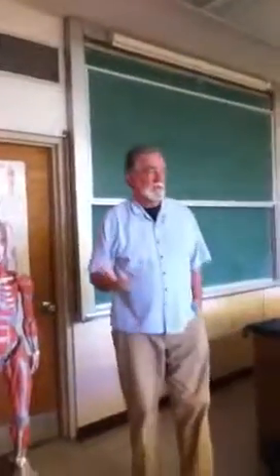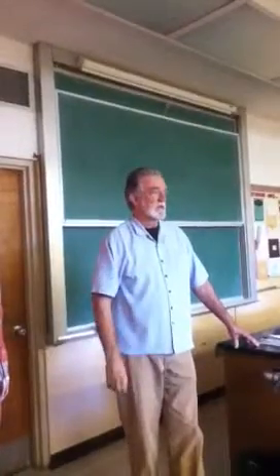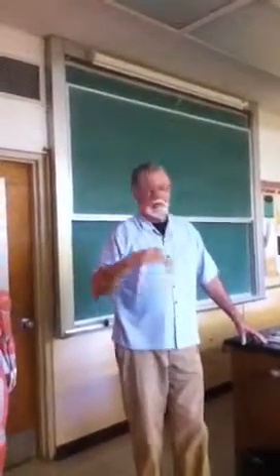But always find the zones, and then what is right below the zona reticularis is going to be the medulla. And just remember, make sure you have the right sequence.